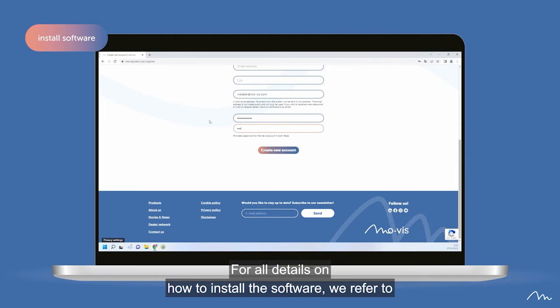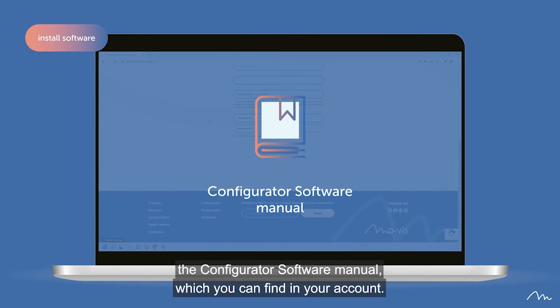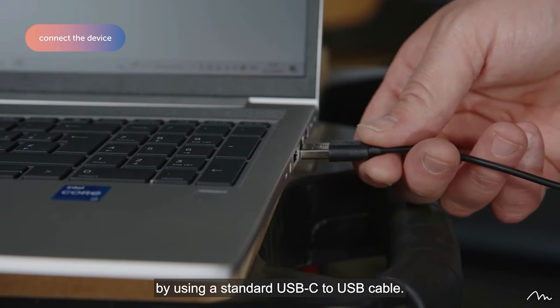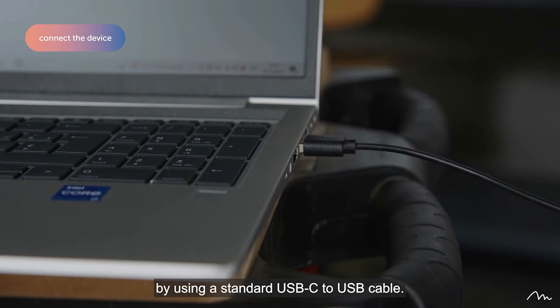For all details on how to install the software, we refer to the configurator software manual, which you can find in your account. Connect the device to a PC by using a standard USB-C to USB cable.